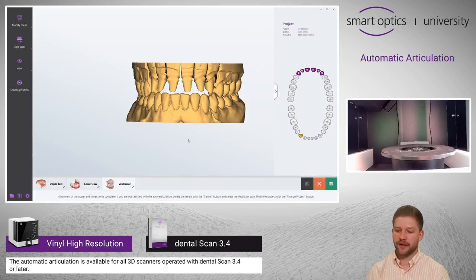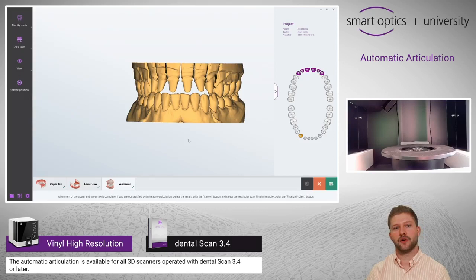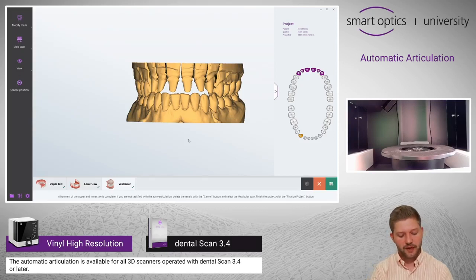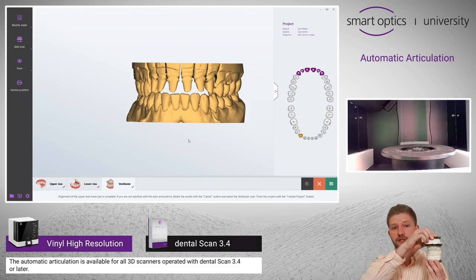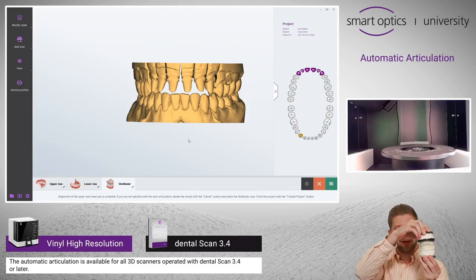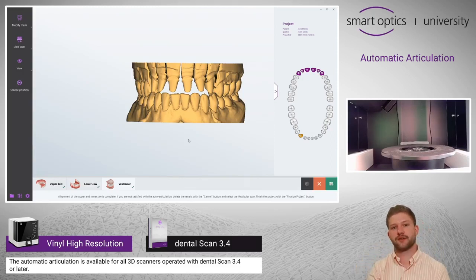You can then start the automatic articulation, or you can even start a normal articulation scan. As a little hint: if you can find the articulation with your hands, the software is also able to find it.